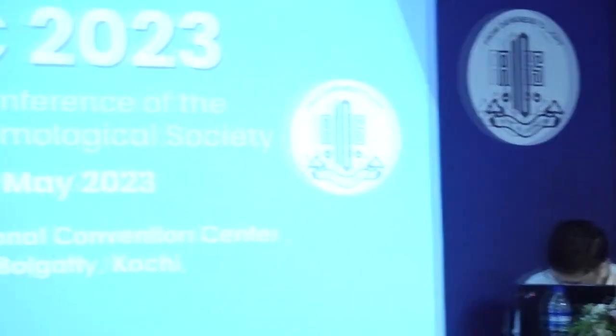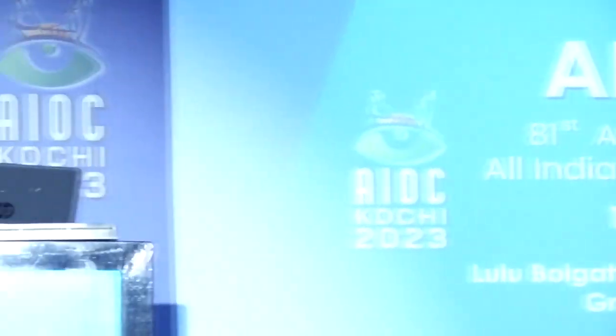What was the indication for ILM peeling? Routinely you peel ILM in all cases having macular folds, which are not removed by simple ERM peeling. I know, but in your cases macular hole was not there, right? No. So what is the indication for ILM peeling is what I'm asking. It is to remove the macular folds which are not removed by the removal of epiretinal membrane alone. Okay, but the case which you showed did not have a macular fold. That was a very well stained ILM, but there was not even an ERM. There are some ILM folds there.